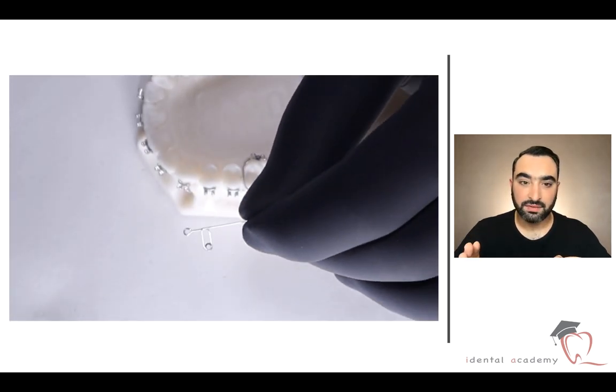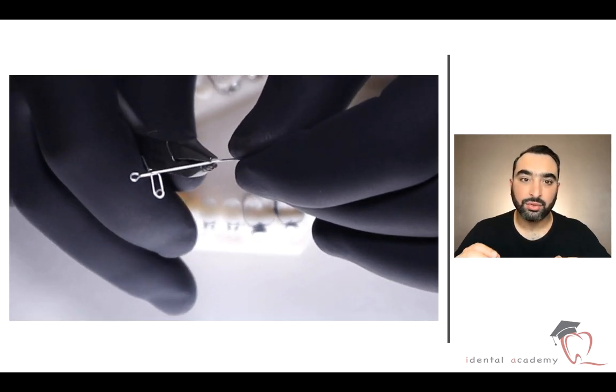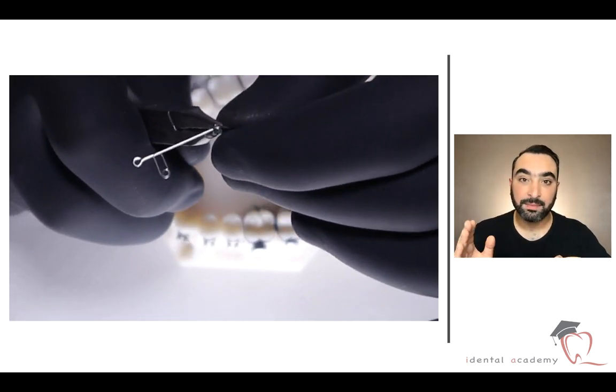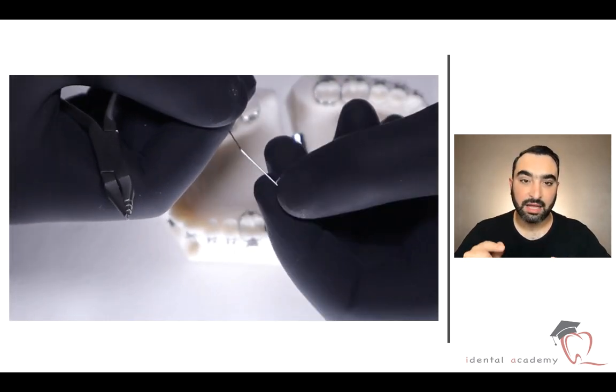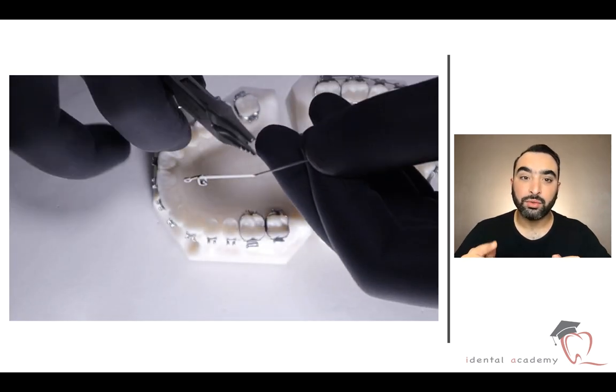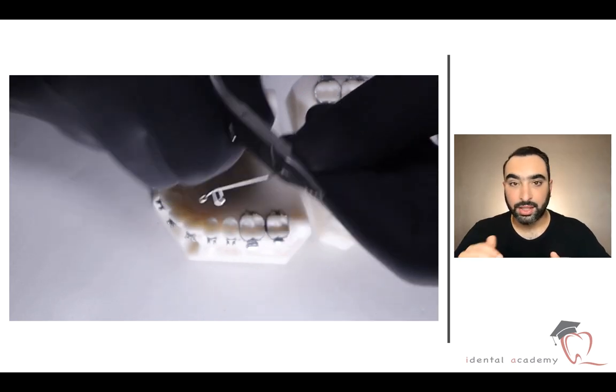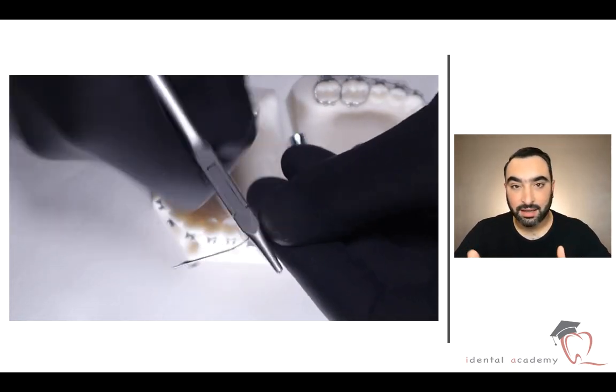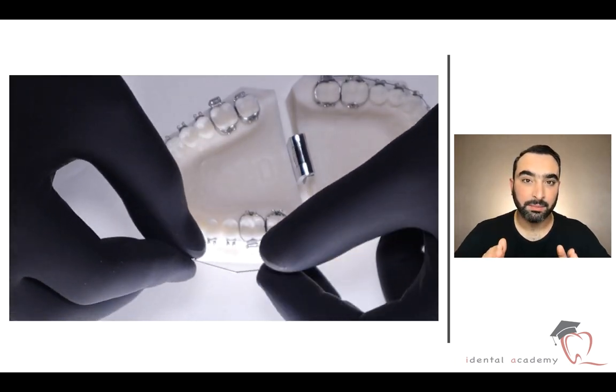The other one is tip-back, also to increase the anchorage for the molar. This is just to face the reaction forces. And for the canine also you have to make like 30 degrees to face the tipping while you are doing the distal retraction, so you will have almost bodily movement.